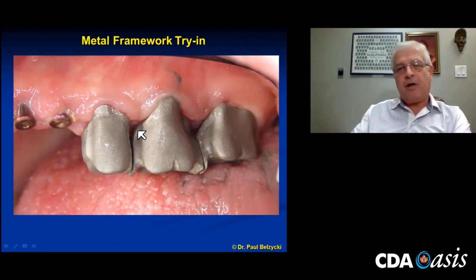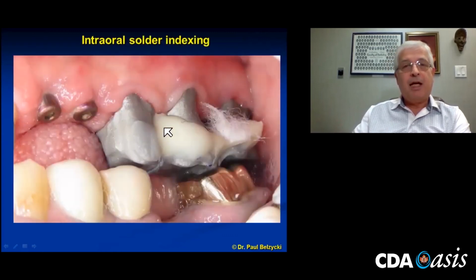When you do periodontal surgery, you become far more respectful of the soft tissue and soft tissue management, because you've seen the hurt that you put that patient through. So you want to back it up with good restorations. And now I will take some tooth-colored resin material. It could be the red Duralay.